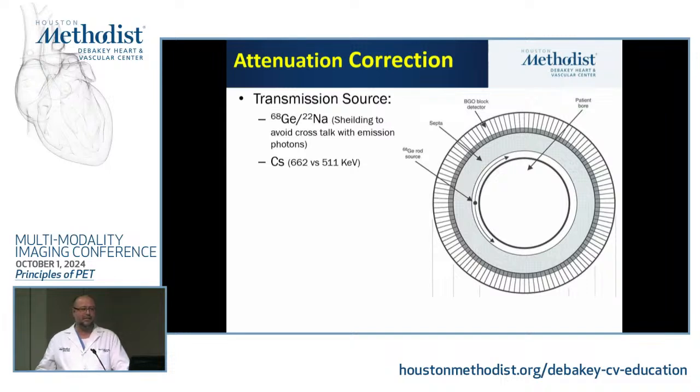Luckily, there are no new systems in the market for these, and now if you go to buy a new one, there's only PET-CT. There are some refurbished systems still in the market and they are being used, but no new systems like this. So within your career, you'll see these systems kind of vanish.